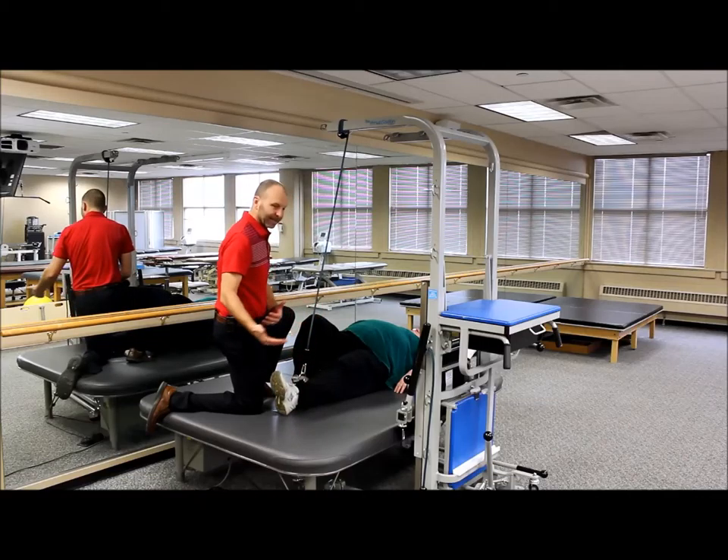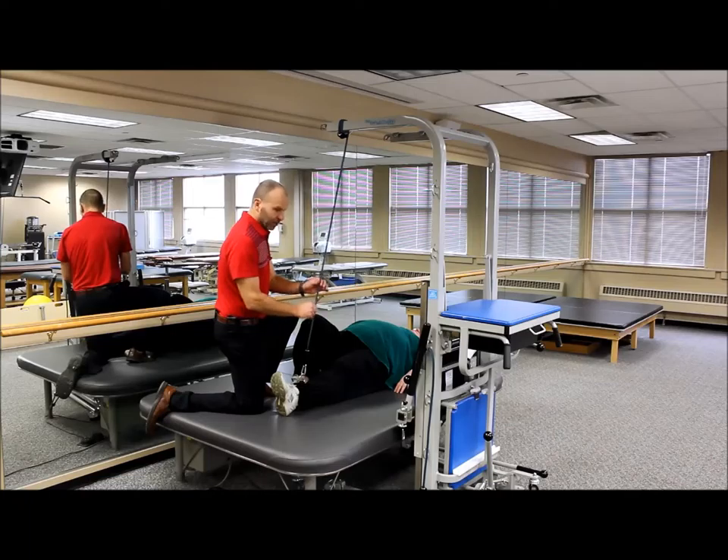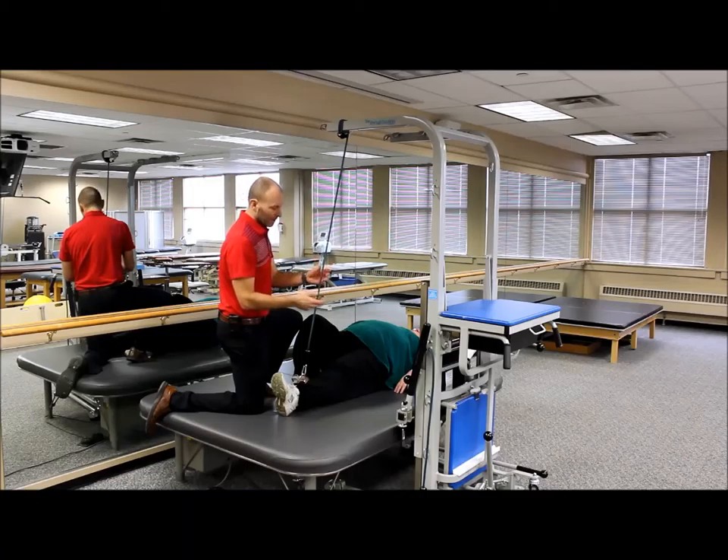So now I can step away, and the patient can go ahead and do those on their own without me needing to be there. We can also adjust the level of help or reduce the amount of help by going to fewer wraps, lower support, or lower resistance bungees.